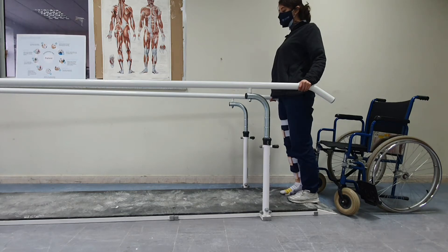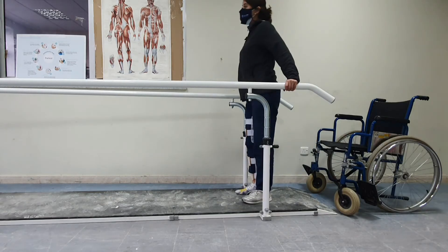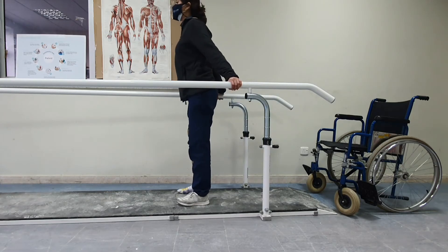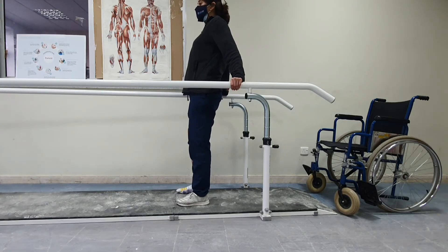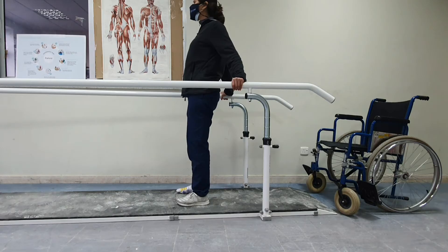Now the patient will learn the proper standing position. When standing between the parallel bars, the patient has the legs at shoulder-width apart and leans backwards, relying on the hip ligaments, with the legs kept in extension.